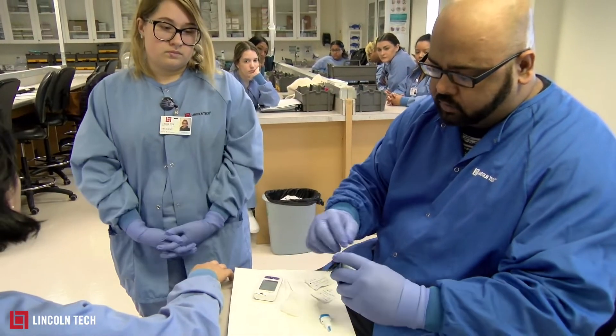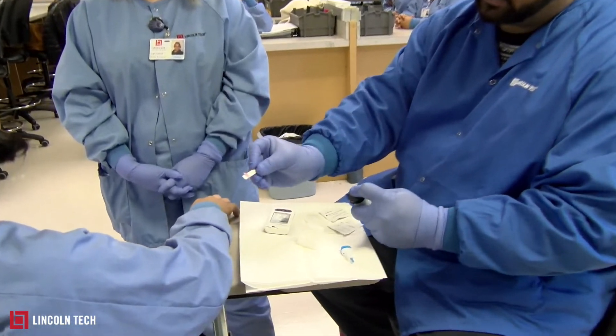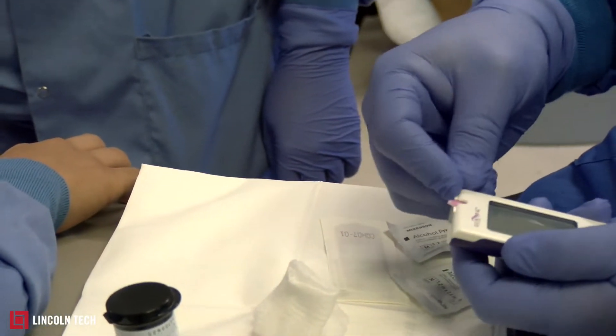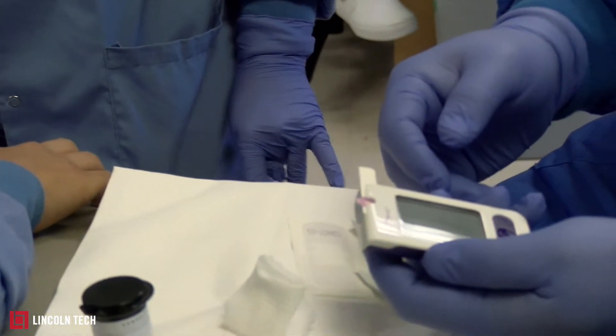I'll show you one of the strips. When you take one of the strips out, that's how it looks. You put this in the machine, and the machine will turn on automatically — you'll hear a beep.